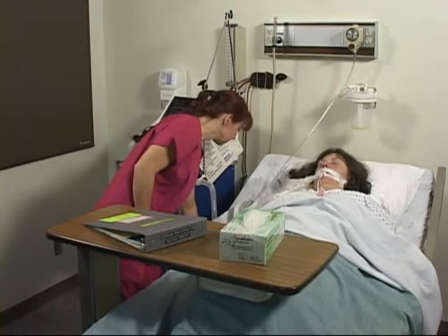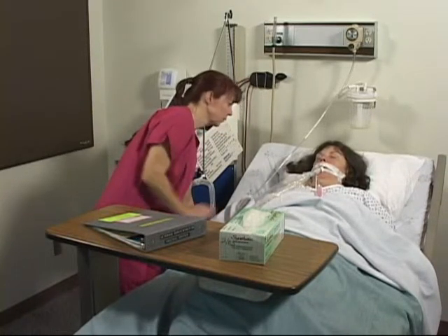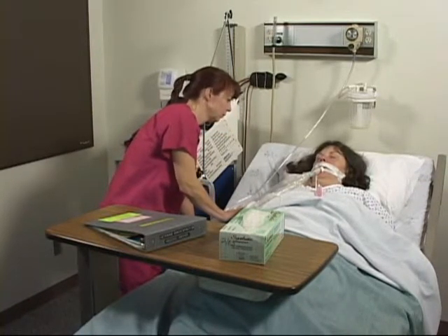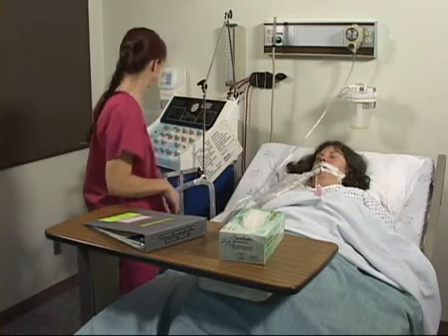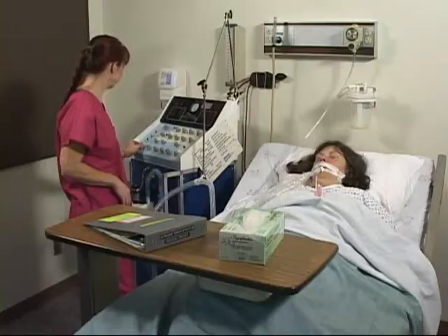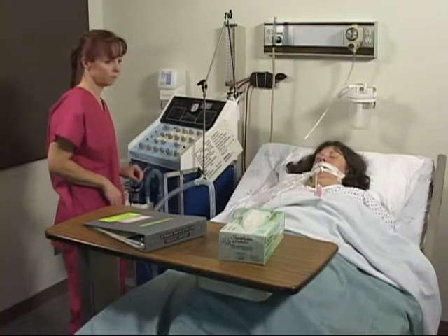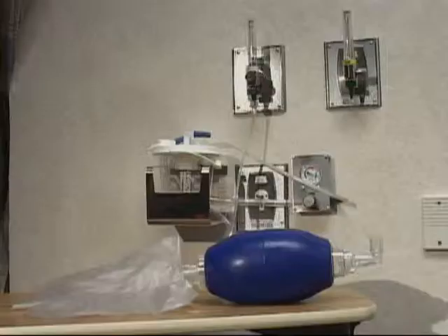Position the client in semi-Fowler's position unless contraindicated. This will promote better air entry into the lungs as well as allow the client to cough more effectively. The client should receive a brief period of high concentration of oxygen. This is called pre-oxygenation. It can be accomplished with a manual resuscitation bag or with a setting on the ventilator. Using the ventilator setting, pre-oxygenate according to agency policy and patient needs. Modifications in this step are made for clients on PEEP.